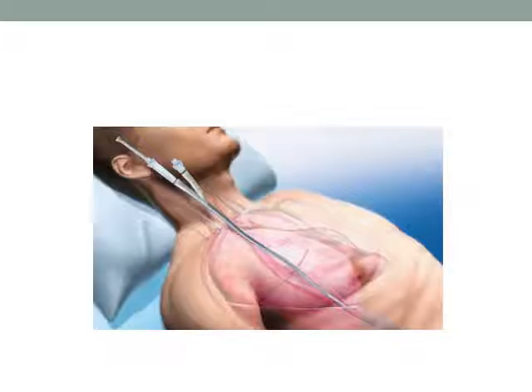It is enormous and can do major hurt if improperly placed. This has happened in every center that places enough of these. You will hurt somebody putting these in. Scary dilators.